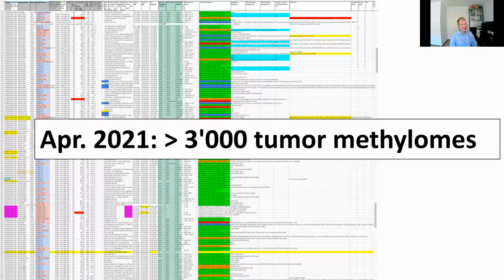So we thought it would be nice, at least for these cases where we don't have enough backbone data, to build up a database that would be able to subject them to unsupervised machine learning. So we could at least look which cases in our database are similar to those cases, to at least have some clinical information for every case that is submitted for analysis.